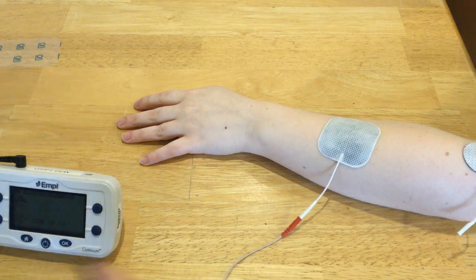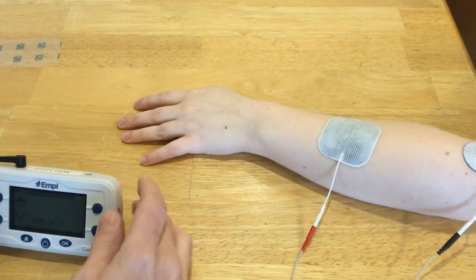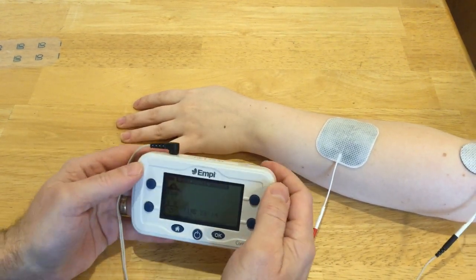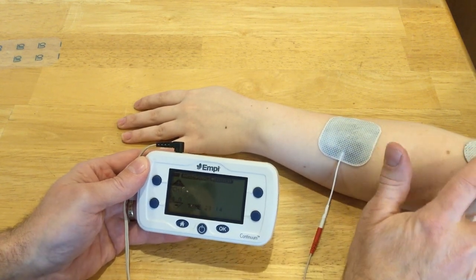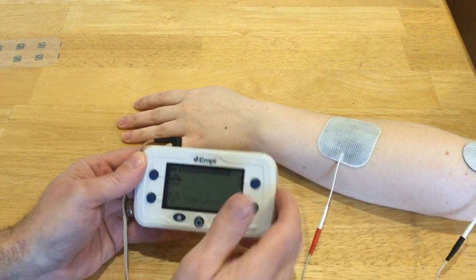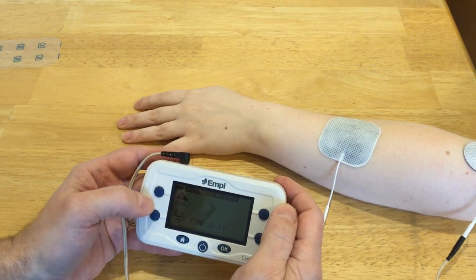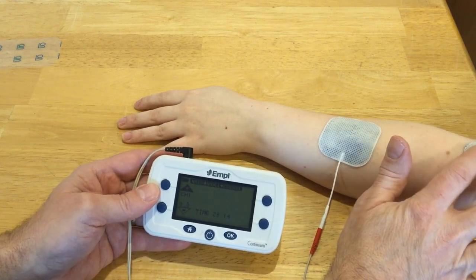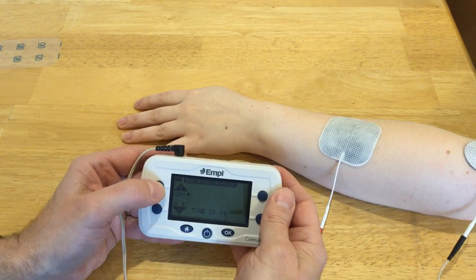I'm going to plug in my black lead wire — which is the primary cathode since I'm using an asymmetrical waveform — into that electrode. This will make it possible for me to hit a smaller group of muscles, or maybe just one muscle. The difference is the stimulation will feel more intense since it's all going through a smaller space.